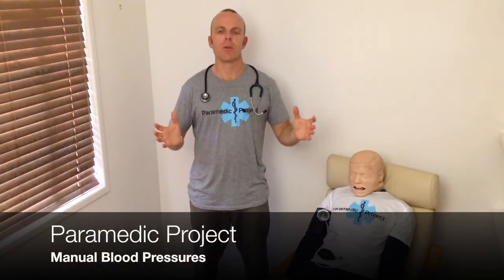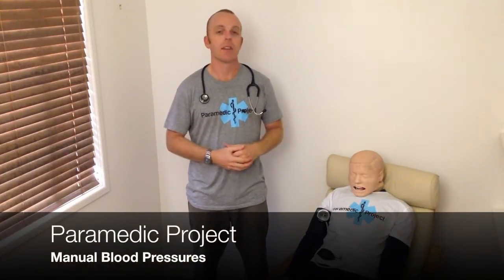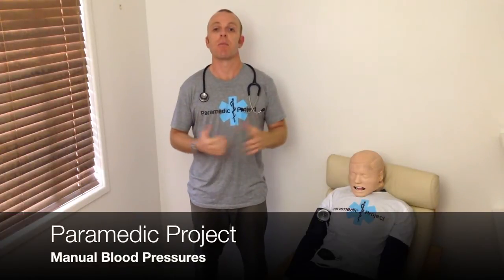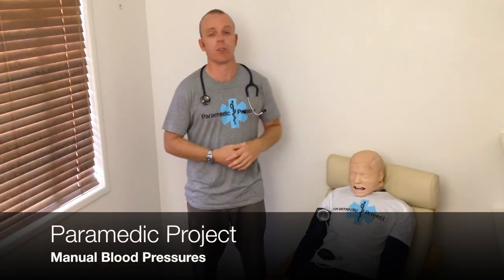Hi and welcome back to Paramedic Project and thanks for joining us once again. Today we're going to talk about blood pressures and taking a blood pressure on a patient.